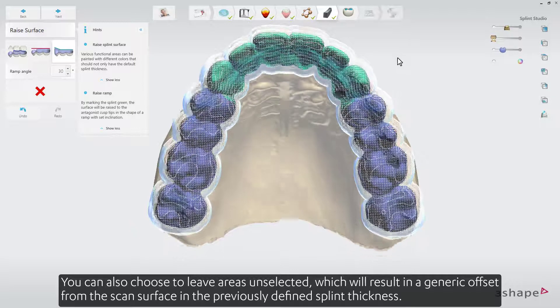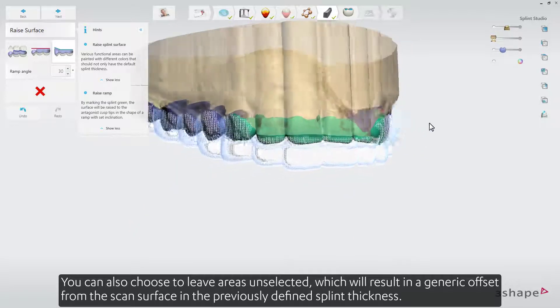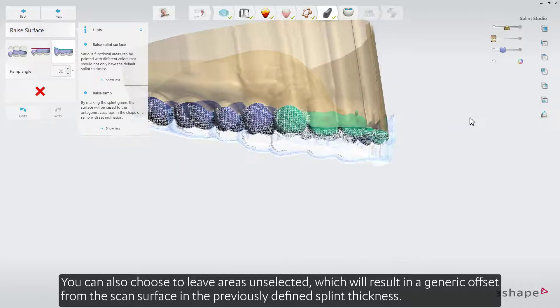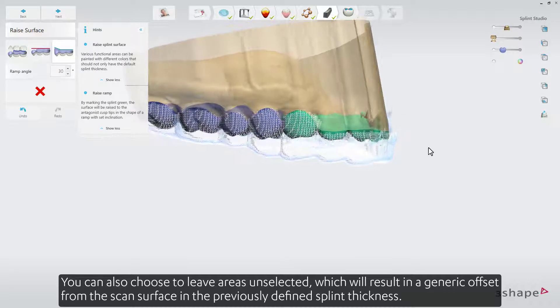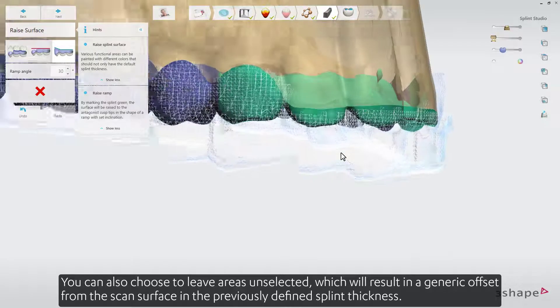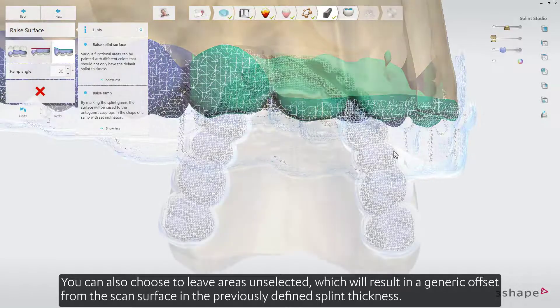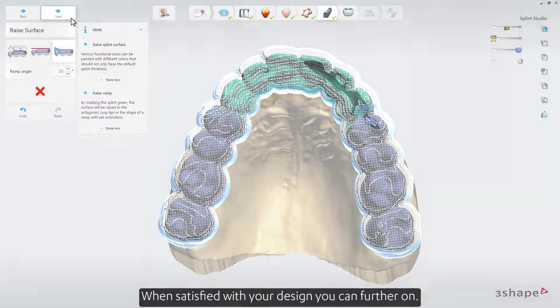You can also choose to leave areas unselected, which will result in a generic offset from the scan surface in the previously defined splint thickness. When satisfied with your design, you can move further on.